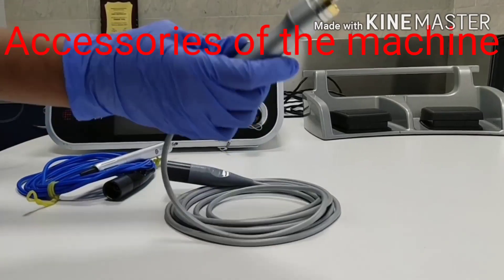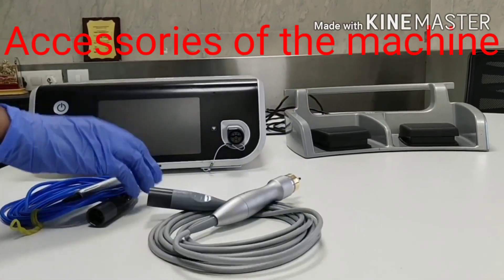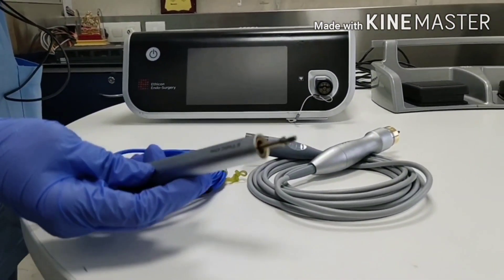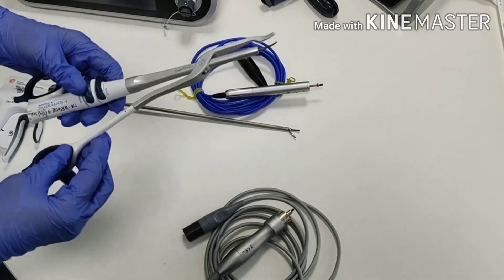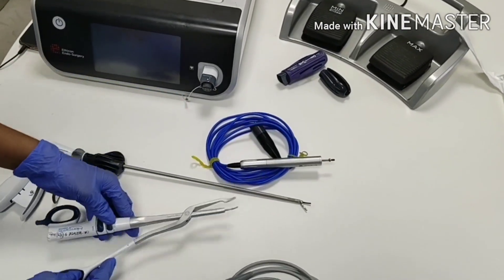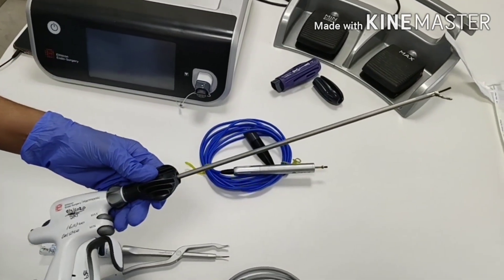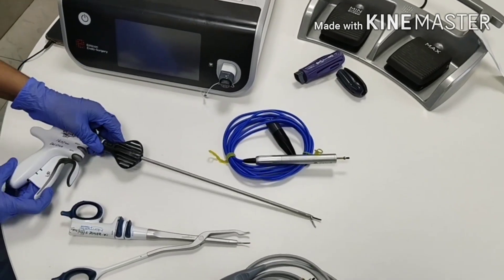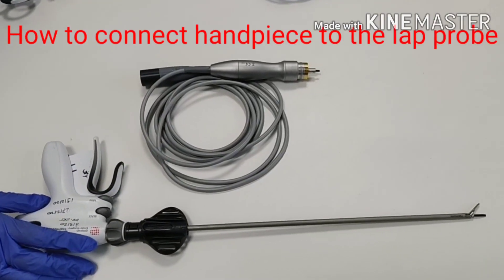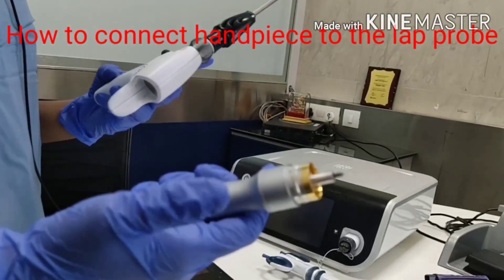We have two handpieces. One is the laparoscopy handpiece, that is HP054. And this one is the open surgery handpiece — we call it the focus handpiece. This is the open surgery probe, and this is the laparoscopic surgery probe.